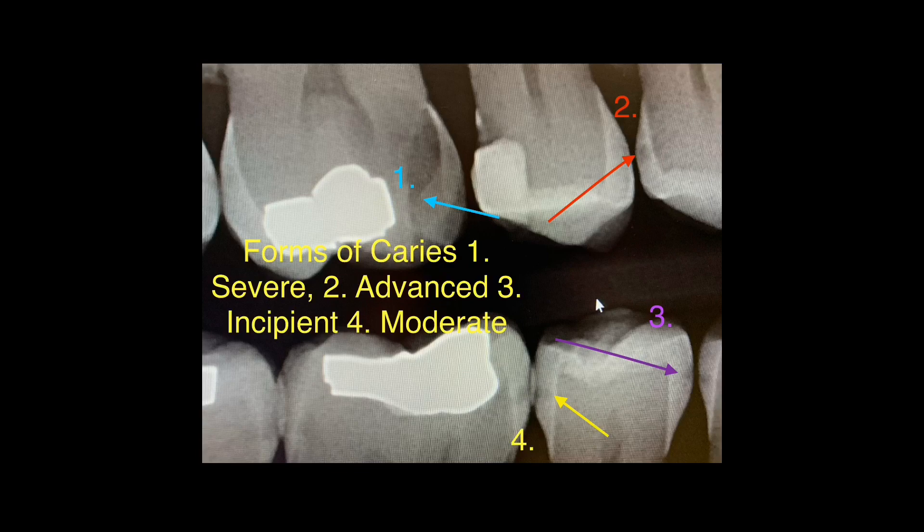Now look at number two, pointed by the red arrow. You can see the caries has completely involved the enamel and there is also a small dark circle visible in the dentine, which indicates it is an advanced form of caries.